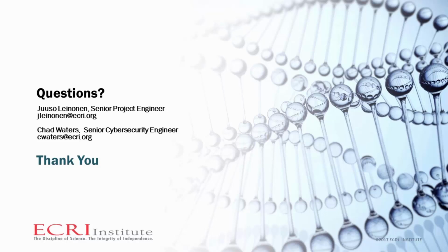And this is Yuso, just to add a key point on that. One of the things that this highlights is just the knowledge of what the operating systems are in your medical devices. From ECRI's member base, we are seeing more and more hospitals focusing on gathering these kinds of data points for all of their medical devices. So whether it's imaging equipment or any other equipment, you should definitely have those software versions and operating systems in your CMMS to enable you to apply some of the security mitigations that Chad just mentioned effectively across your entire fleet.